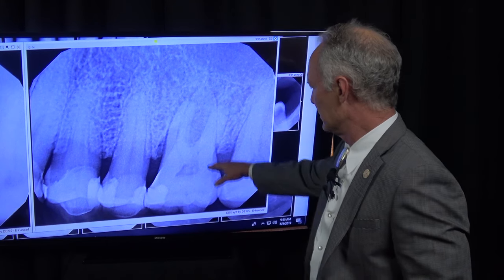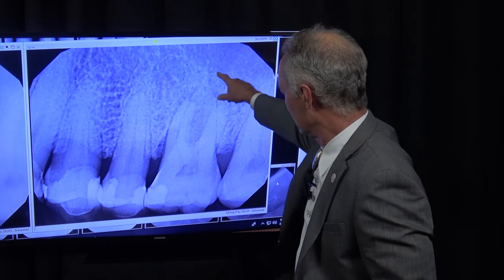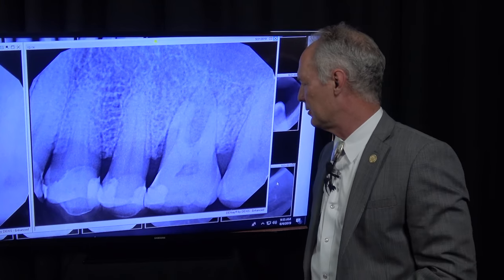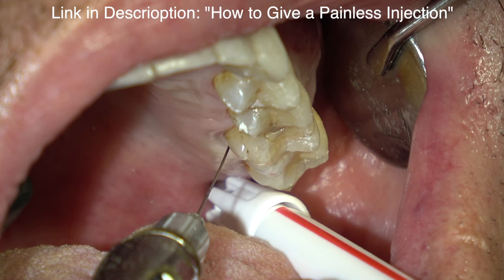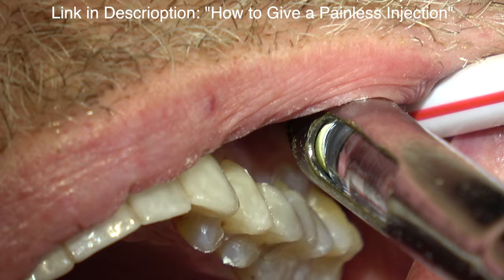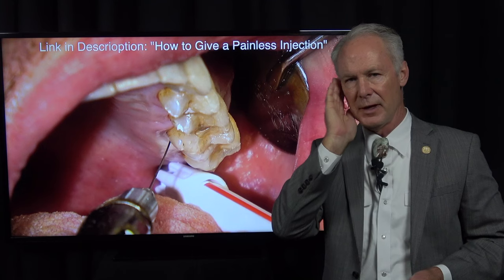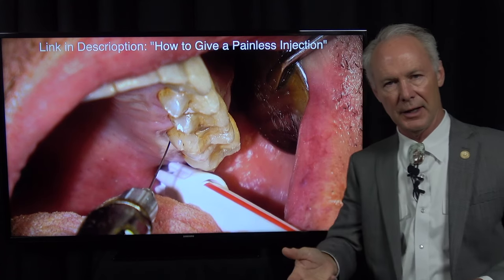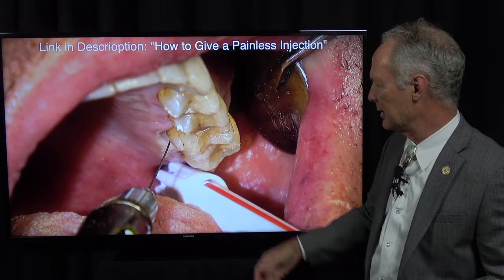This tooth has got infection all around it and it's to be lost. You don't want to take the tooth out in one part because the roots are spread. If you do extract it in one part, you're probably going to lose the buccal plate or the facial wall of the socket. And since we want to place an implant after the socket has healed, we want to preserve the socket.